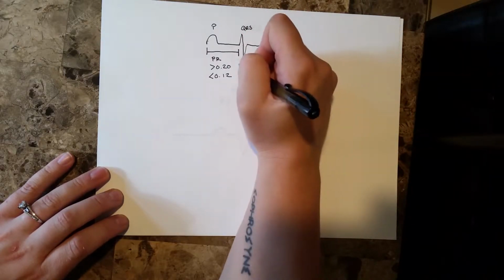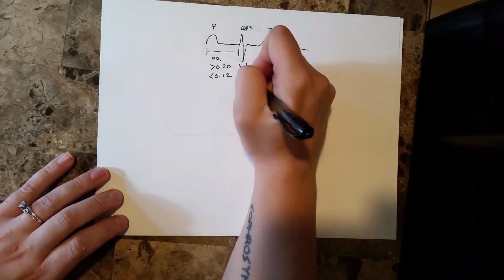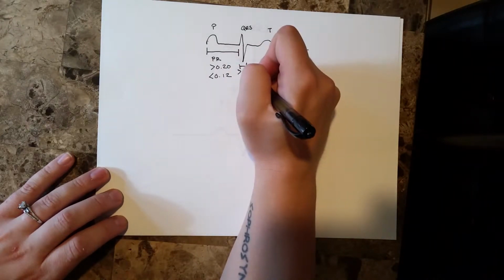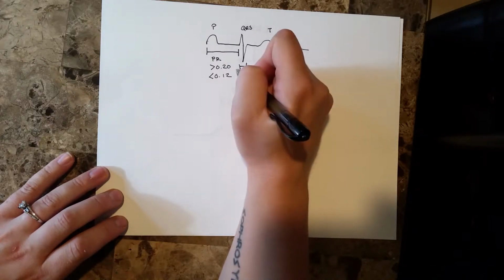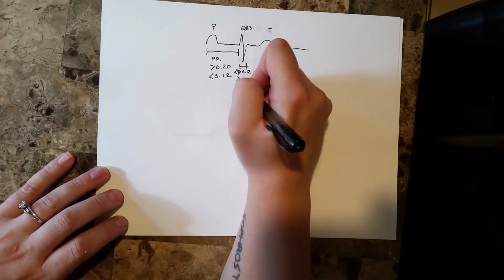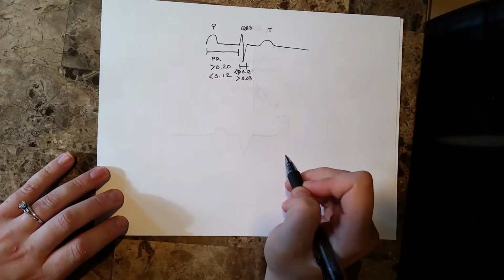Second is the QRS. That is going to be less than 0.12. I'm sorry, I wrote that wrong. Less than 0.12, but greater than 0.08.